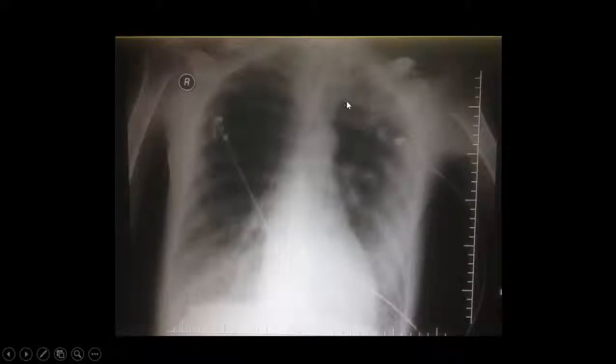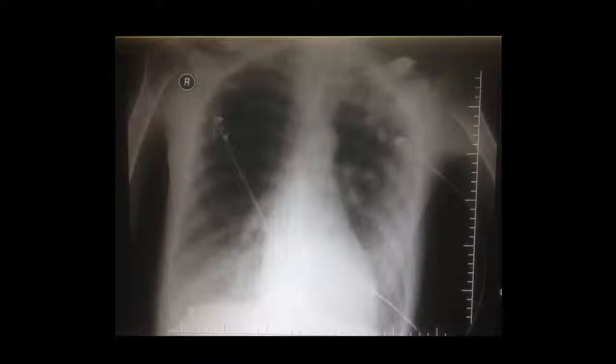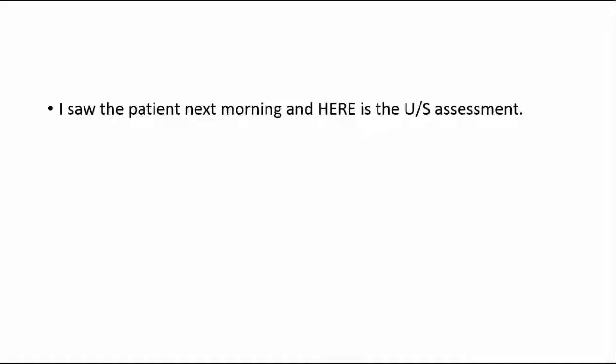Looking at the chest X-ray, the night team diagnosed community-acquired pneumonia and started fluids and connected the patient to a high-setting mechanical ventilator. I saw the patient the next morning and performed an integrative ultrasound assessment.